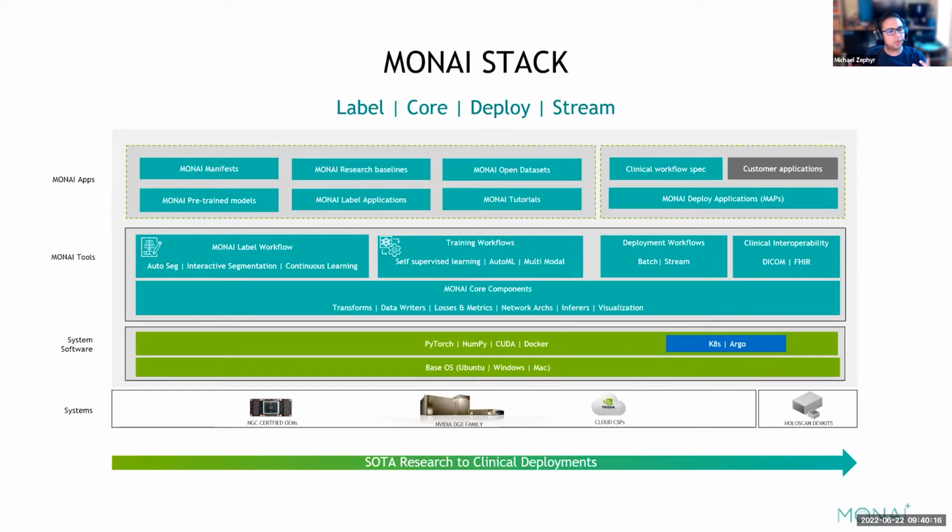And then you move up and you have that workflow that I just talked about. So you have labeling to training to deployment. And last, the very top layer is sort of our MONAI apps, or sort of our MONAI high level things that you can integrate with.